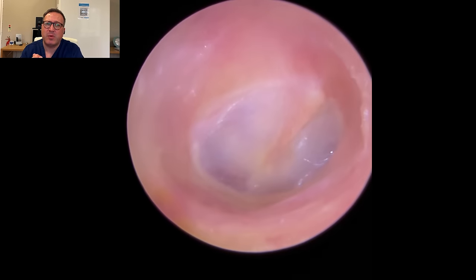As we lift, it's almost identical to the first ear. You've got this free-moving block of wax right at the entrance, which is slightly thinner than the canal, and we're going to get a really good grip on it now. But as you can see, it's very dry - just a little bit crumbly. So as we get a grip on it and start to move it, it starts crumbling away off the edge of the wax. There we go, it's coming away really nicely. So we've got that front section away. You can see there's a much deeper rear section in here as well. It looks like it's filling most of the canal - there's a very slight gap at the top but the rest of the canal is completely covered.